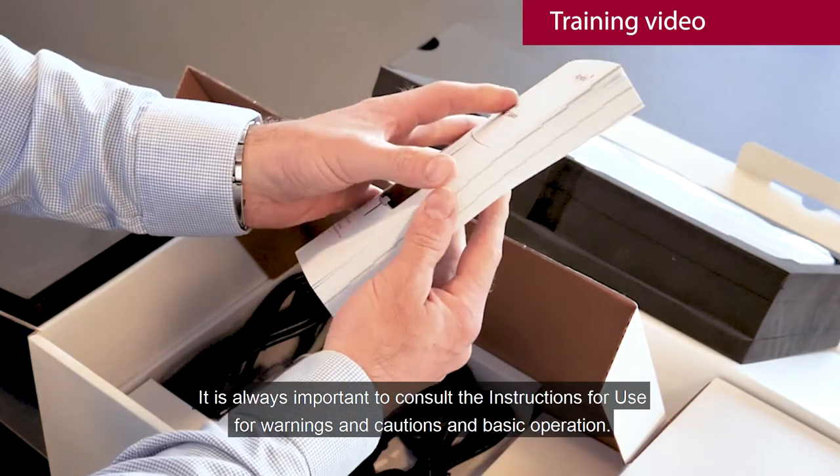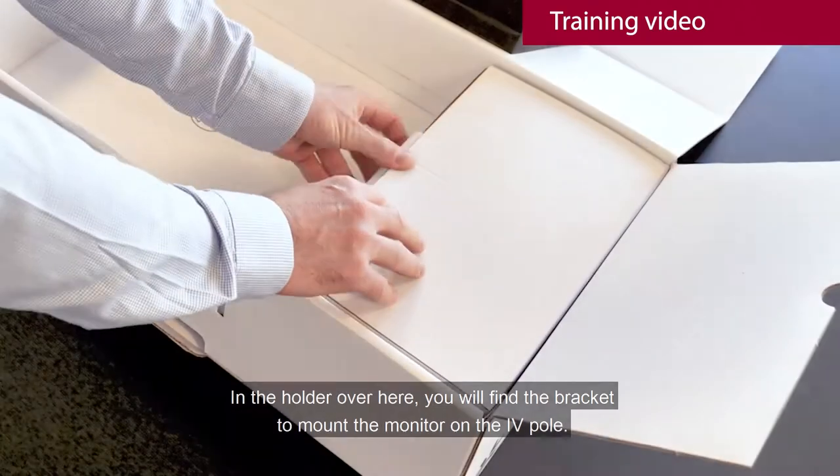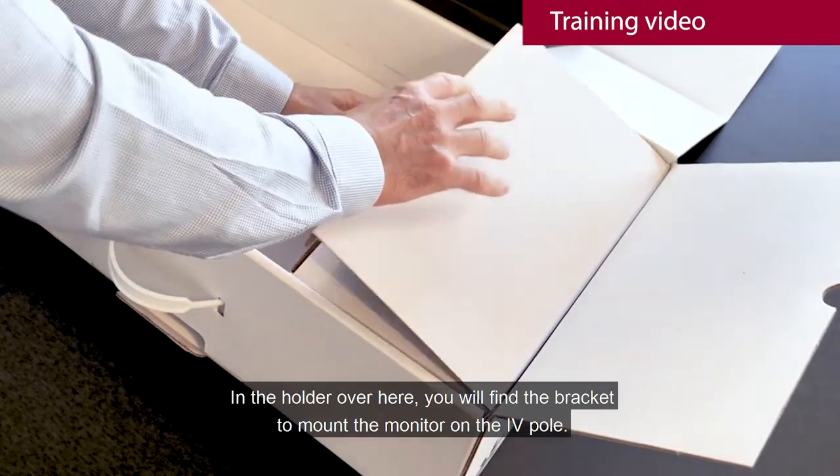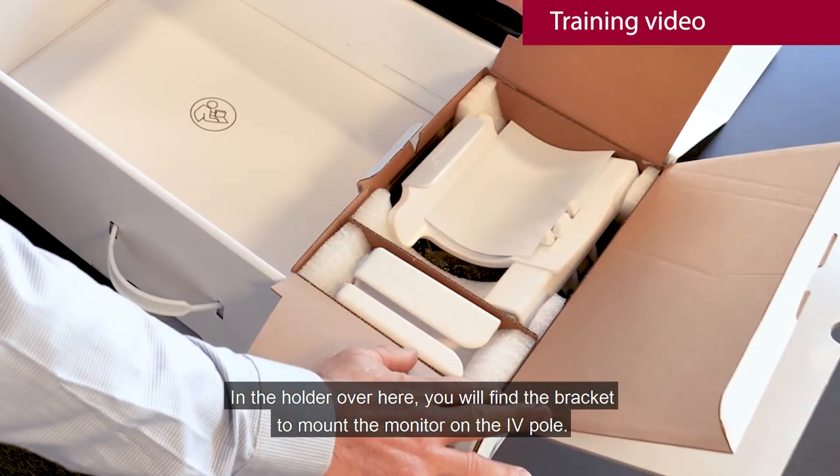It's always important to consult the instruction for use for warnings and cautions and basic operation. In the holder over here, you find the bracket to mount the monitor on the AVPOOL.